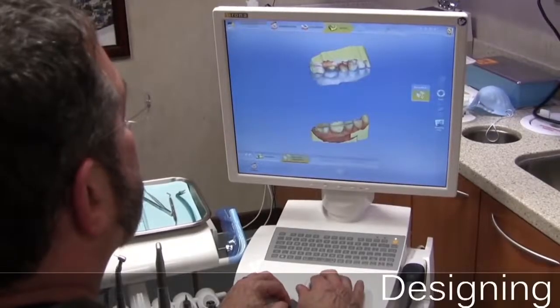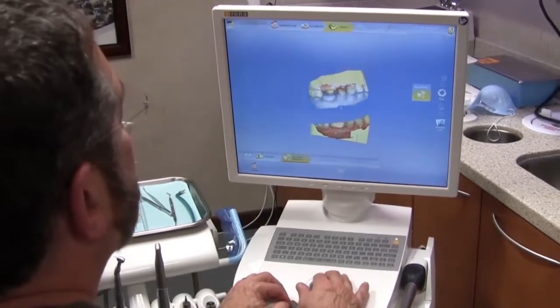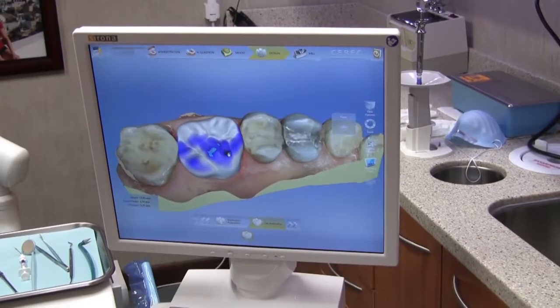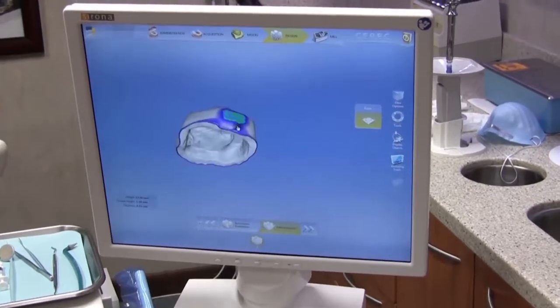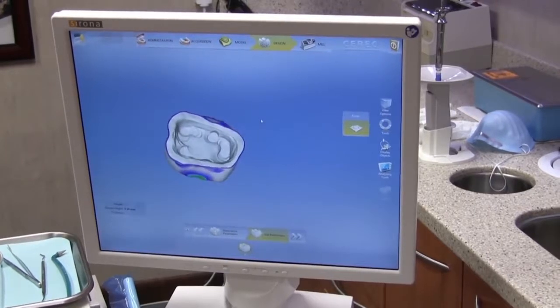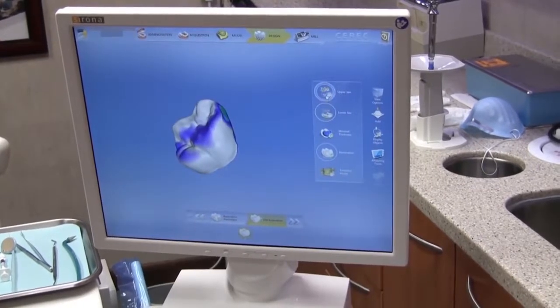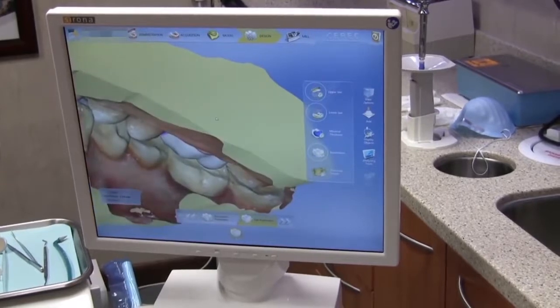Once the digital models are created by the computer, the models are put together to mimic the patient's bite. Then the computer generates a proposal, which is edited and further designed by myself to ensure all parameters are correct. Unlike many other dental offices, you will have a new completed custom crown made in our office in just one visit. There are no temporaries to fall off, which eliminates the need for any return visits.